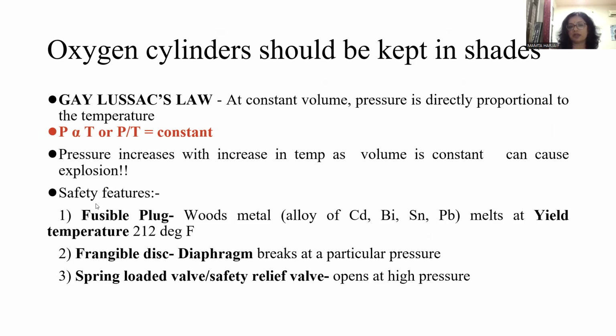Another law comes into the picture here, that is Gay-Lussac's law. Gay-Lussac's law says that at constant volume, the pressure is directly proportional to the temperature. So if the temperature increases, the pressure will increase, keeping volume constant. So what happens? It can cause an explosion. That's why oxygen cylinders should not be kept in the sun. They should be kept in shade.